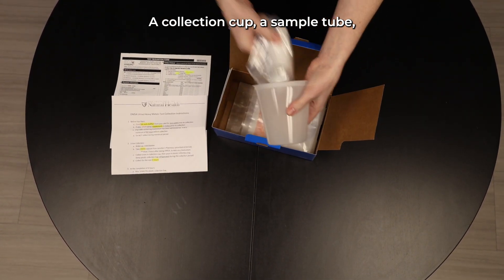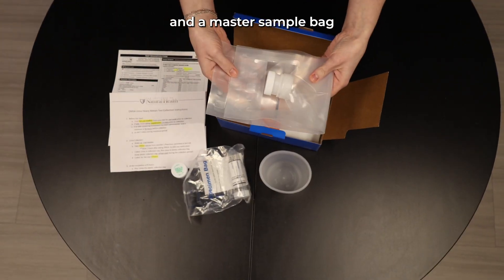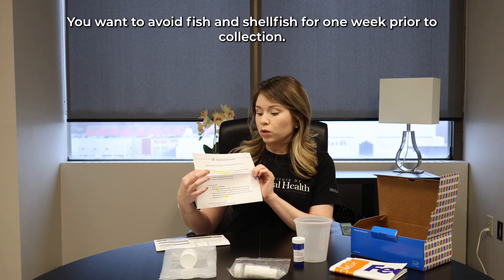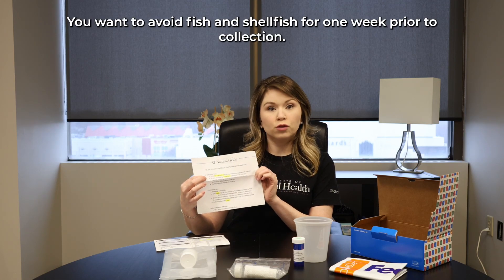You will also see a DMSA capsule and a master sample bag to hold your urine through the duration of the collection period. You will also have a FedEx bag to return your sample in.